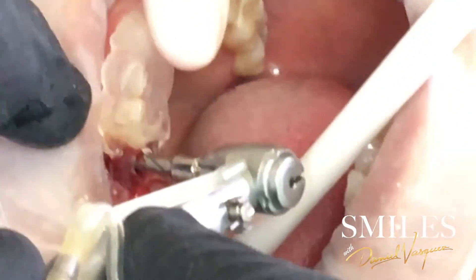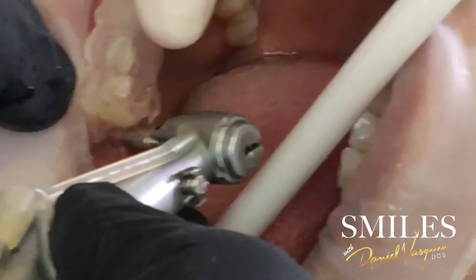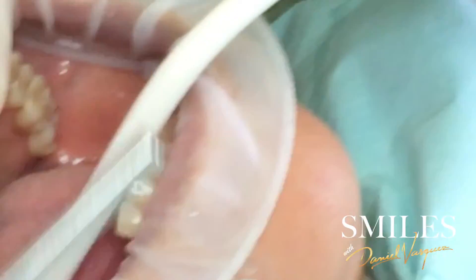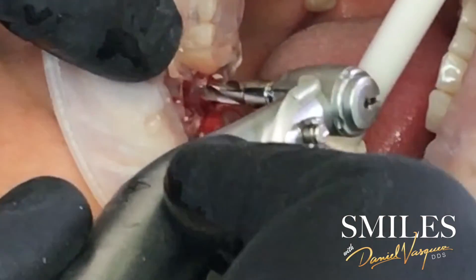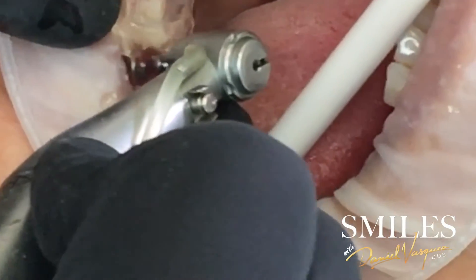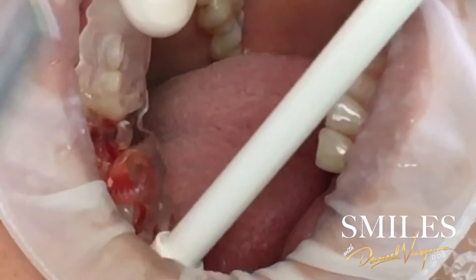Hold it tight please. I like that the drill goes very nice. And we're going to get the last one. That was my last drill.